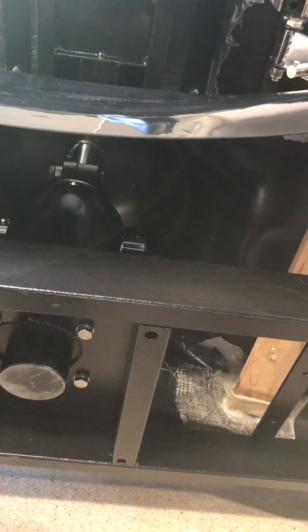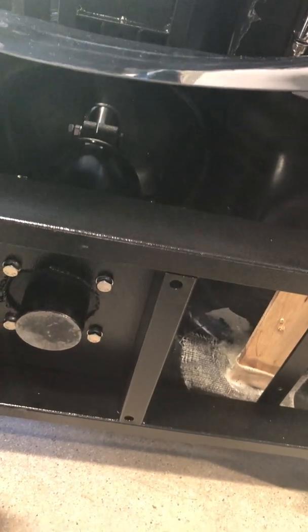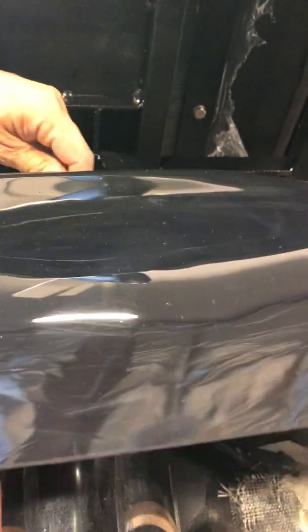And once you take it apart, putting it back is simple. Make sure when you're putting it back, this side of it is facing like this. So let's just say this is the new pedal, I'm gonna go ahead and put this back in here. One end of it will be sticking out from the cover. And now we're gonna put it into these holes right over here, one on the right and one on the left.